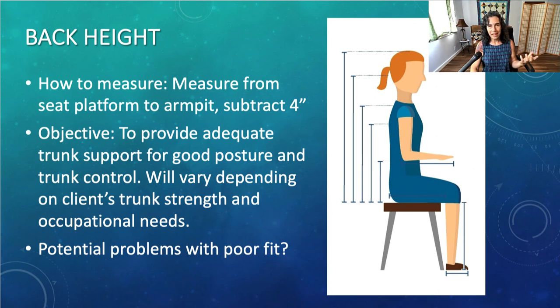All right, back height too low: inadequate trunk and postural control for some clients if they don't have good postural and trunk control.